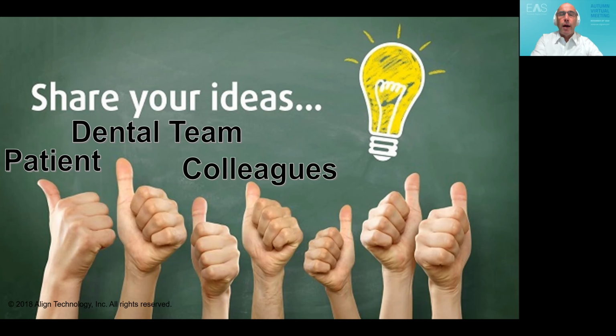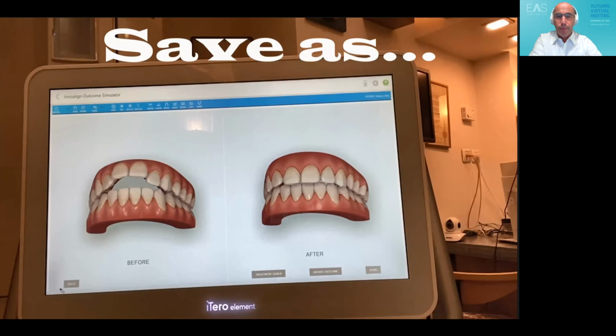Then we want to share our ideas with our colleagues. It can be more orthodontists working in the office, students. And last but not least is a technician. And I will explain to you what I do with this simulation and how the technician of Invisalign is involved.